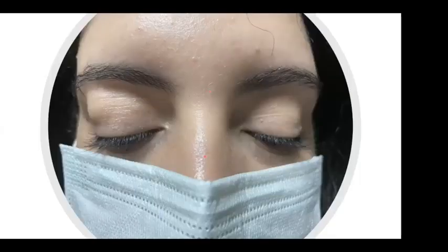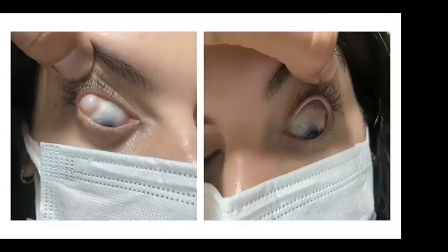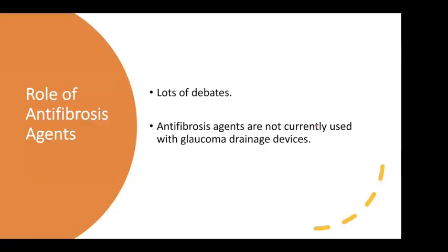So look at this girl. She received a bilateral implant, so you can see the right eye. The implant is very prominent. The left eye, there is nothing, but she received an implant for this. She's an only-eyed patient. This eye is an absolute eye with the implant very anterior, you see. And this one, there is an implant which is very posterior. She has very, very advanced field loss. But again, when you see that the valve is placed very posterior, cosmetically it is very acceptable to the patient. So nowadays, I just tell them that the appearance usually is not very bad.